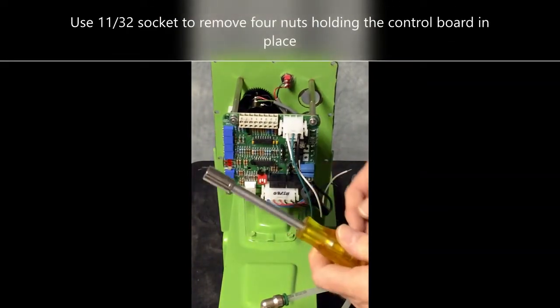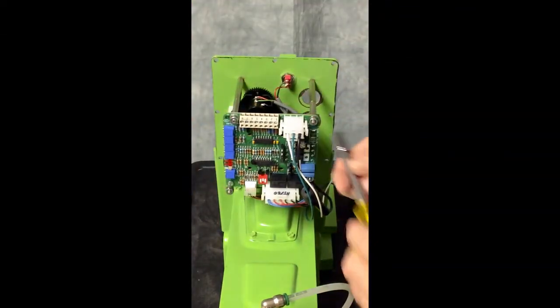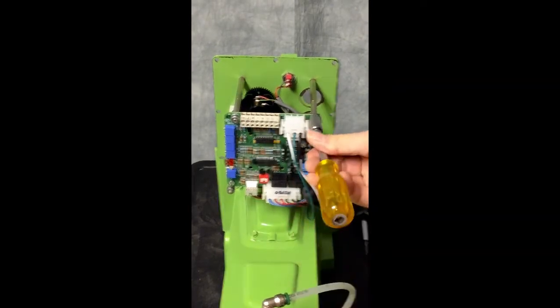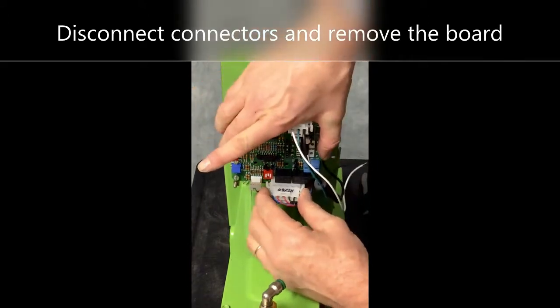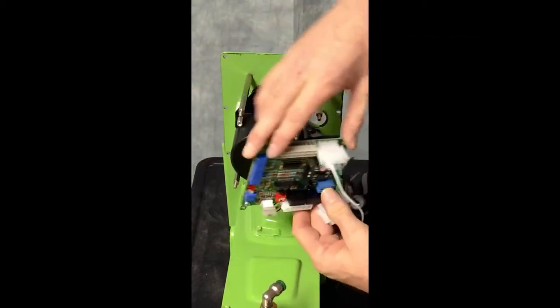Use an 11/32nd socket to remove the four nuts holding the board into place. With the four screws off, you can now unplug the motor from the control board and remove the control board.